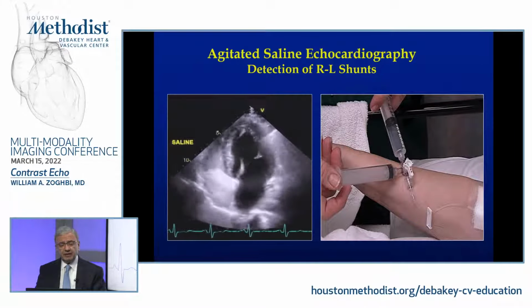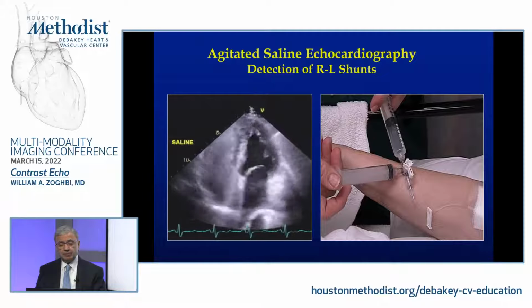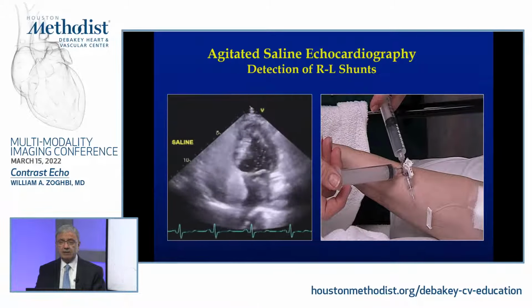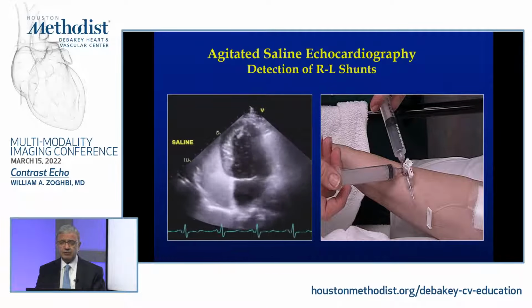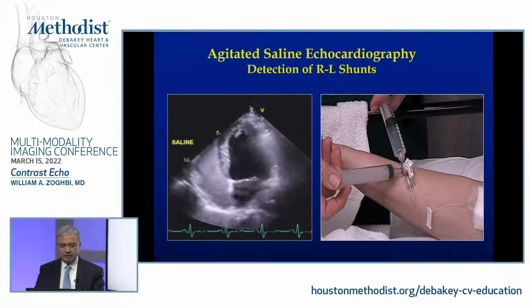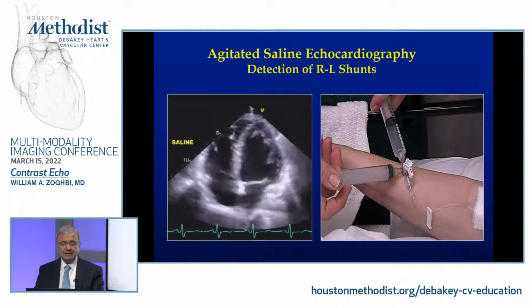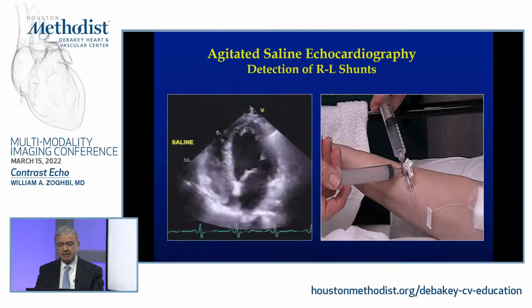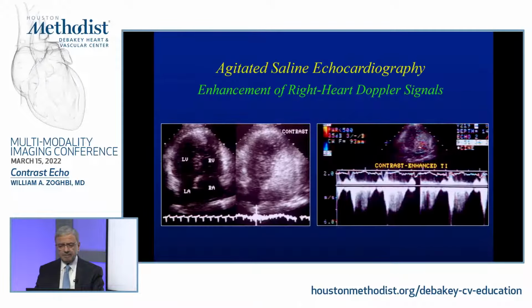So you got to be very careful about that, as opposed to the pulmonary AV shunting where it occurs always late, and it's a continuous infusion of contrast that you will see that accumulates over time. So keep those in mind when you're trying to differentiate that, because I still see quite a few of these misinterpretations at times in the echocardiography laboratory.